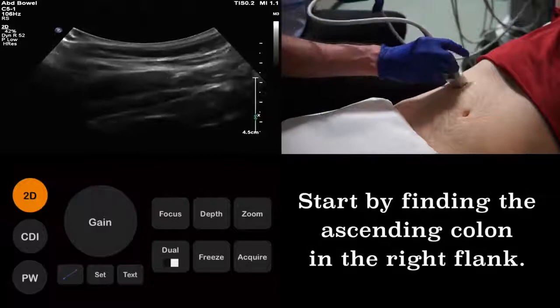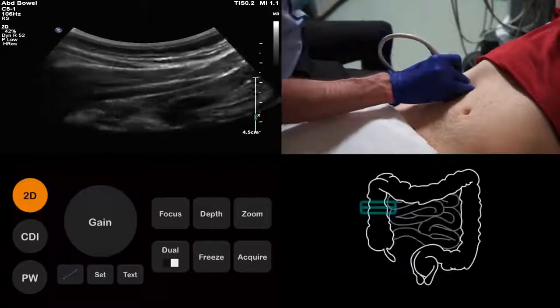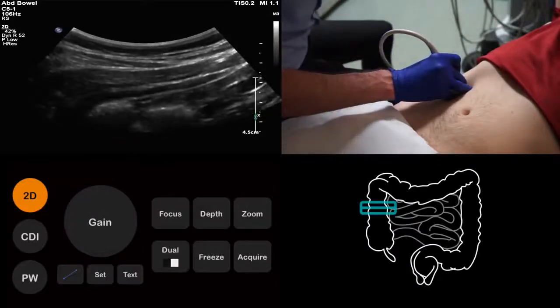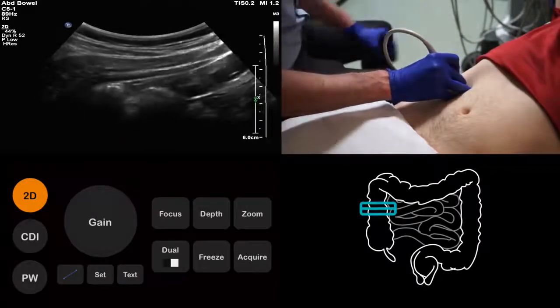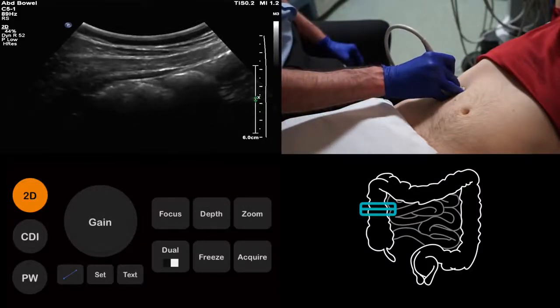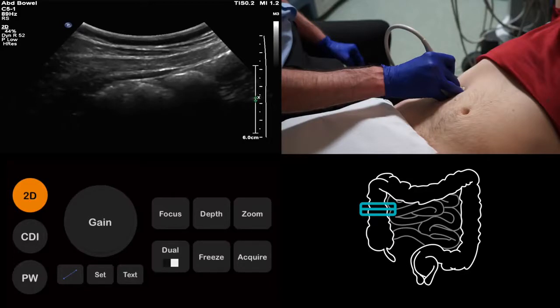Although the appendix is located in the right iliac fossa, we start with a probe in the right flank. This is because we need to define the local anatomy before we head for the appendix. Our first task is to identify the ascending colon. If we can find this structure, then we can scan inferiorly to locate the cecum, from which we know the appendix will arise. As the bowel is likely to contain gas, the ascending colon will appear as a densely echogenic structure.